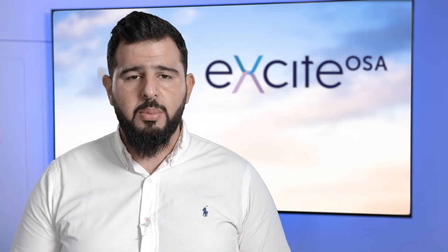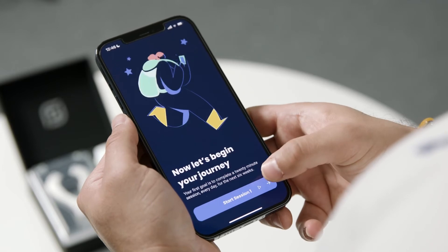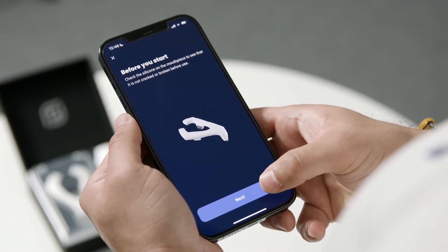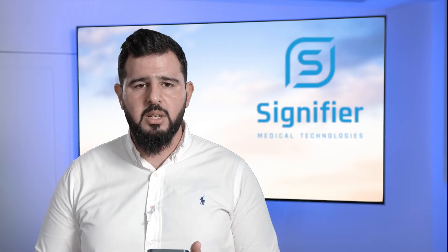When you've set up your profile on the mobile application, connect your Excite OSA device and start session one. You'll then get a sequence of screens telling you to check the device for any damage or any abnormal material that is on there.